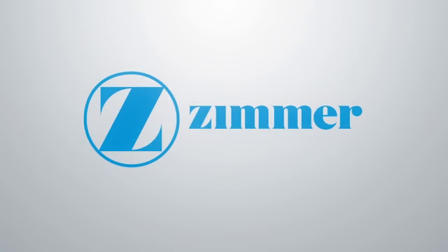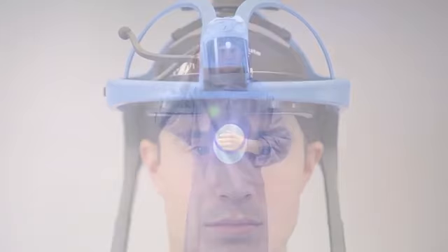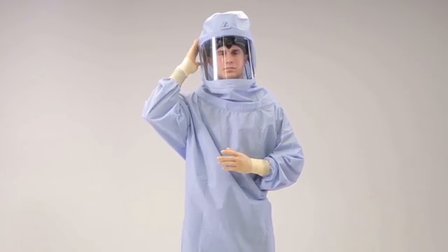Hello and welcome to the video tutorial on how to don the Zimmer Total Shield Surgical Hood. The Total Shield Surgical Hood is for use with the Total Shield Surgical Helmet and Total Shield Advanced Surgical Helmet with LED lighting. The Total Shield Surgical Helmet System is intended to be worn by surgical personnel to provide a barrier between the operating environment and the surgical personnel in order to protect against contamination and exposure of infectious body fluids and harmful microorganisms.